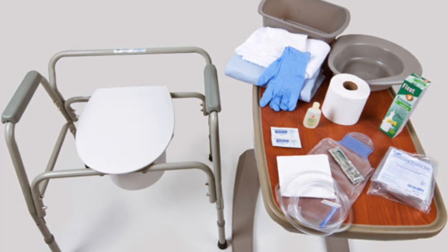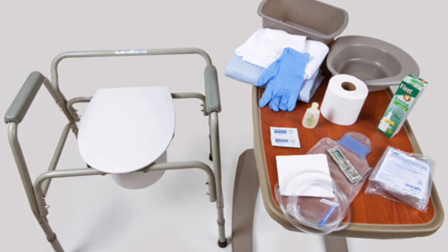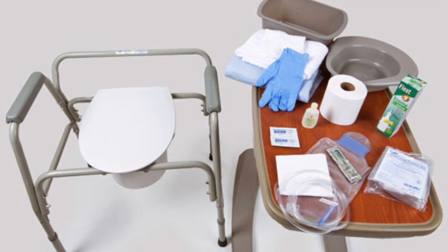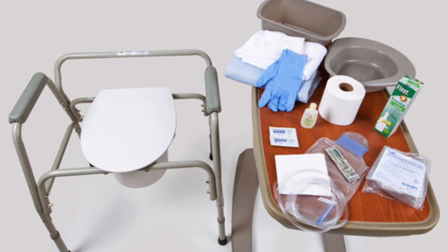During this time, you want to stay at the patient's bedside. It's important that you ask the patient to retain the fluid as long as possible because longer retention promotes stimulation of peristalsis and defecation. Next, discard the enema container, remove gloves, and perform hand hygiene. Help the patient to the bathroom if possible.